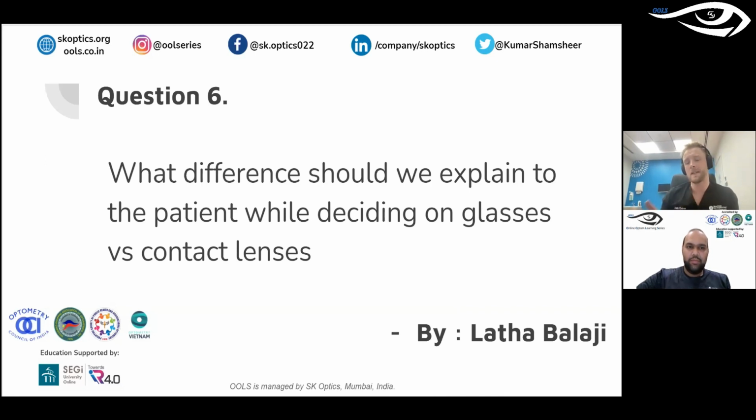So send the patient away or ask them to make up a cheap pair of glasses and go and try it out. They'll give you feedback either in the clinic or quickly after if the vision isn't good enough. Generally, you'll know yourself if the patient's happy with the end point. But don't forget that to really get that crisp, clear 6/5 vision, you're probably going to be going for lenses.